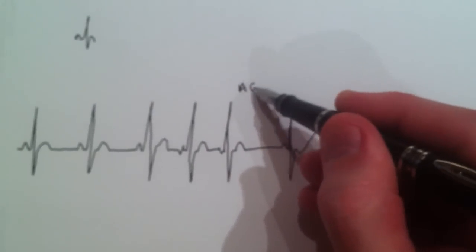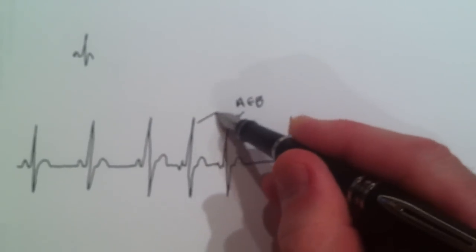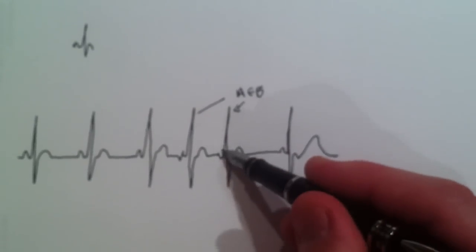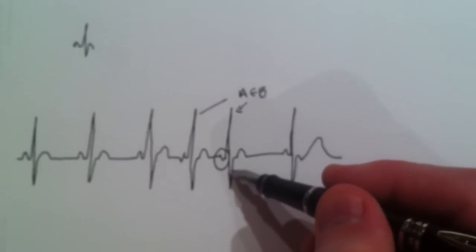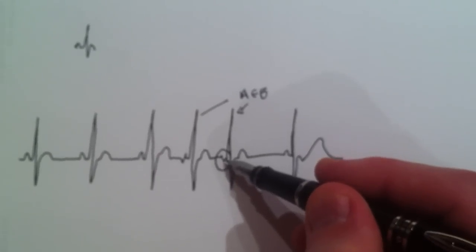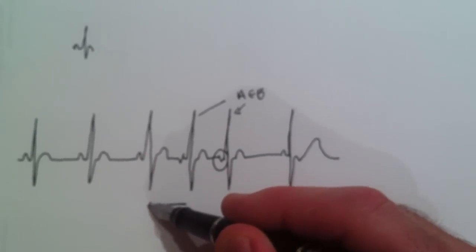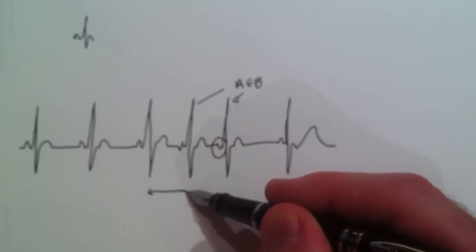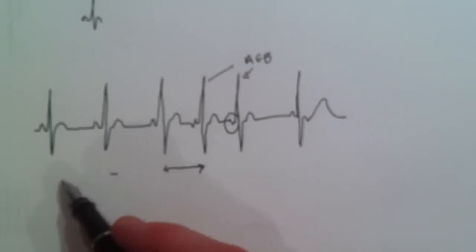These are called atrial ectopic beats. This one, this one. Recognizable by the fact that the P wave, the bit before the big beat, is a slightly different shape. And the interval between the last normal beat and the extra beat is slightly shorter than the normal interval.